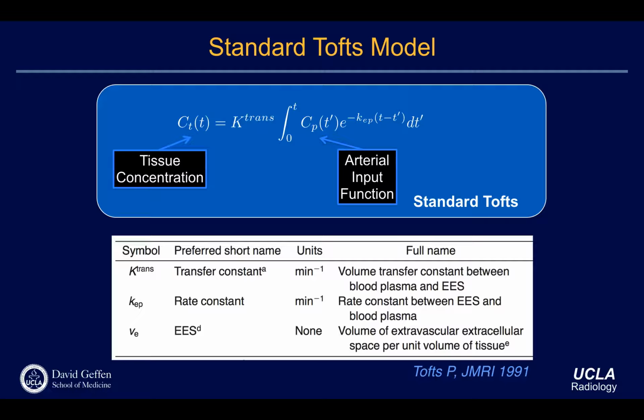Okay, so I think you're asking about how fast it goes in and how fast it goes out, right? This is basically the quantitative value that shows how fast flux in and wash out. Typically, if K-trans is high, that means the contrast agent goes into the tissue very fast, right? What do you expect in the signal intensity curve? It has to be really rapid, right?